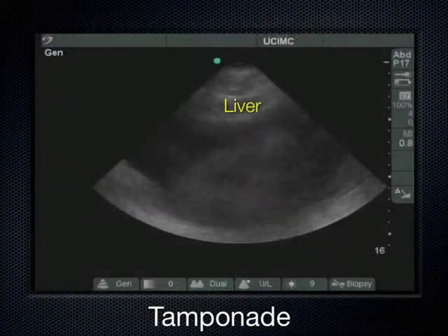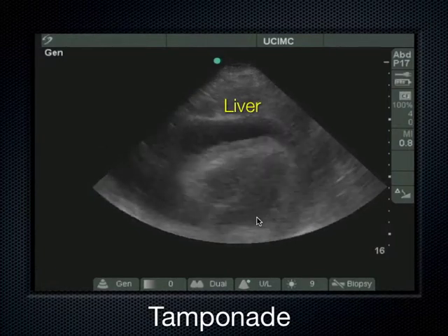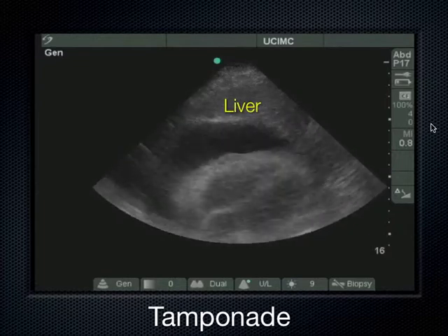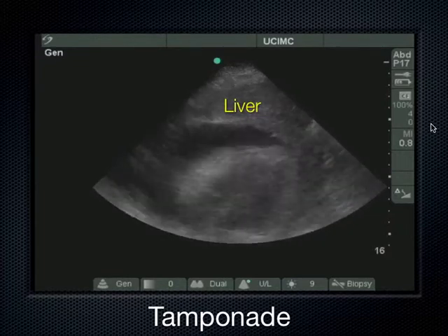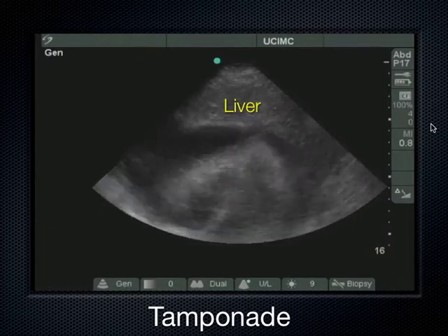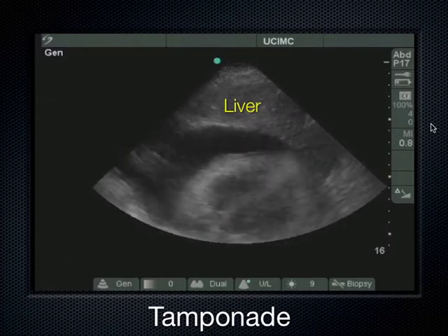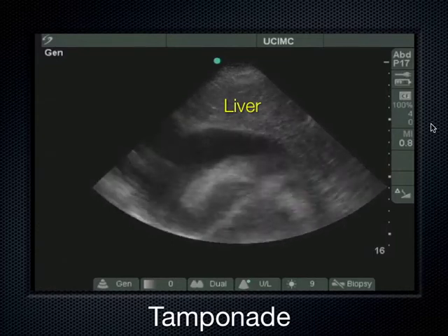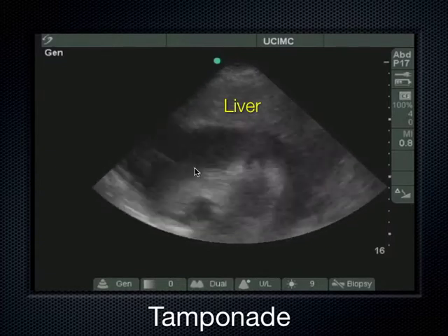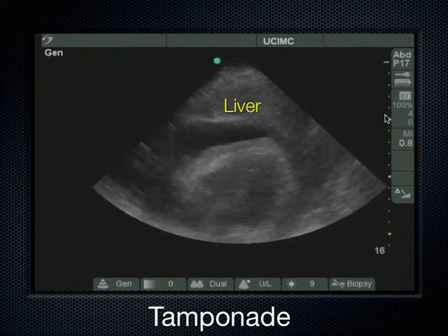All right, what do you think's going on here? Well, I already have it labeled for you as tamponade. I can see this heart swinging back and forth. That's another sign that the patient's in tamponade; you would expect to see electrical alternans here, the heart actually swinging back and forth, tethered by its great vessels. This patient also has a little epicardial fat pad. On the outside of that RV it's kind of subtle, but there's a little fat pad there.